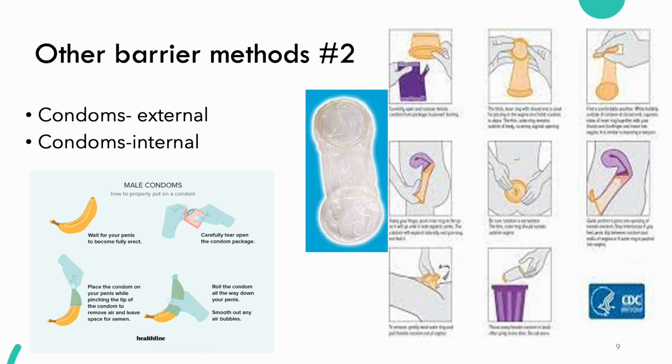I decided that this wouldn't be complete if I didn't address condoms, both external, also known as male condoms, and internal condoms, also known as female condoms. The external condoms are devices that can be made of a variety of materials: lambskin, latex, synthetic materials. Most marketed, probably 80% or more in the United States, are made of latex. The synthetic materials are intriguing because they have longer shelf lives, and they're compatible with both oil and water-based lubricants. But it isn't so well established how well these protect against sexually transmitted infections. So that's just a little caveat if you're counseling people who need STI protection as well.